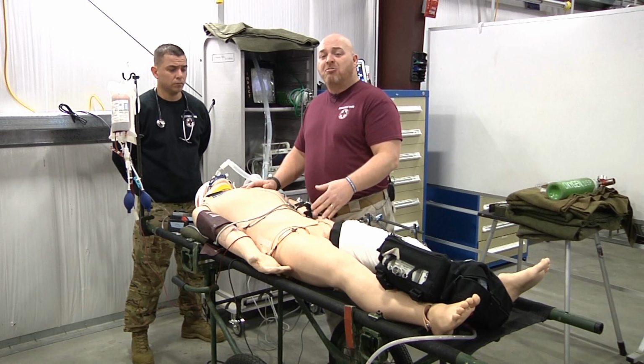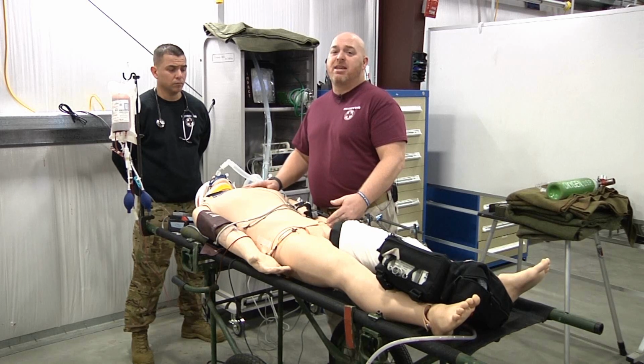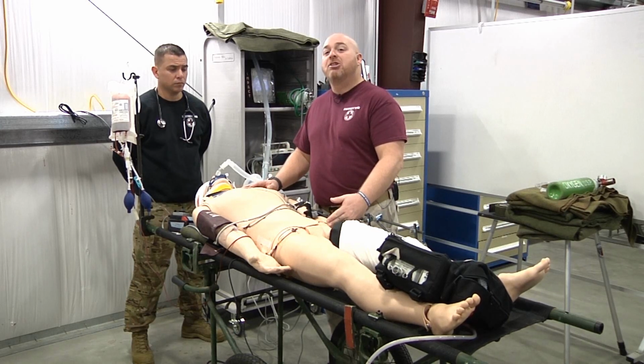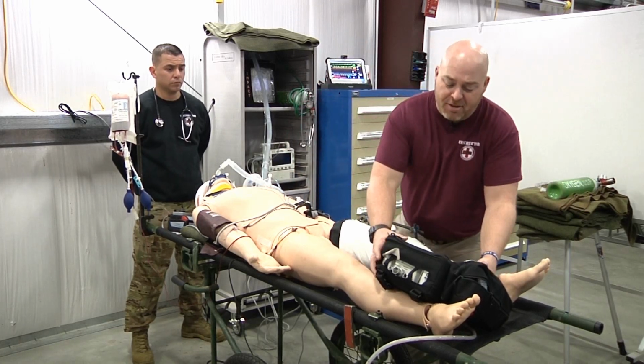And so as we're here for a longer period of time, we don't want to use one of our bottles before we even get into the aircraft. So keep your patient on hospital oxygen as long as you can while putting the patient on your vent. We're going to start setting the patient up on the vent.